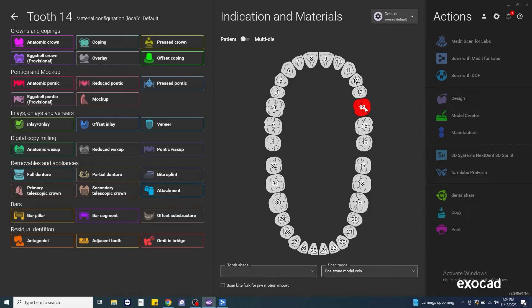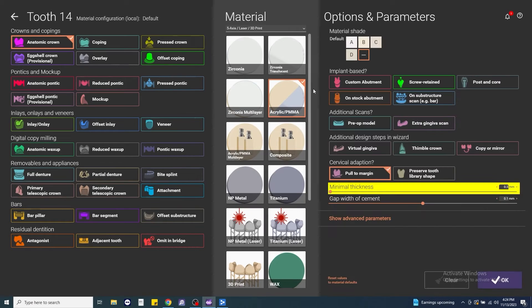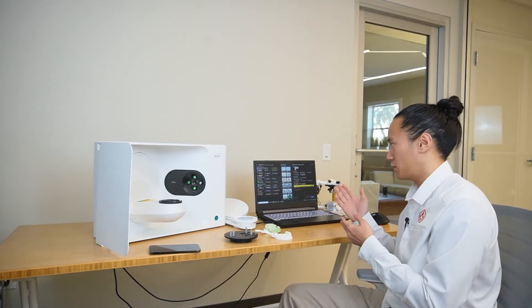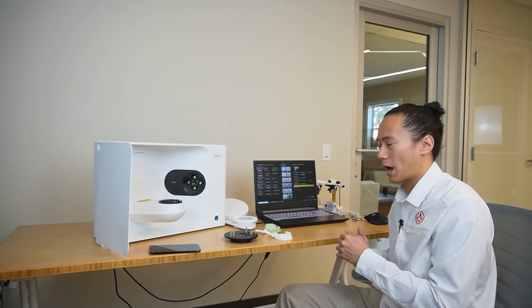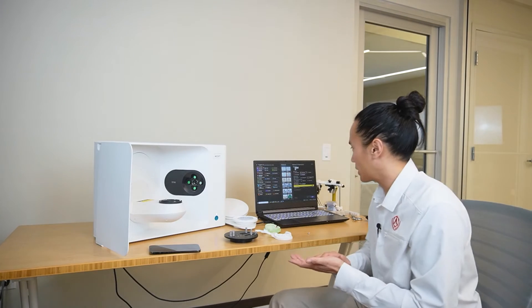And we'll set up our working tooth first, anatomic crown. We'll mill this out in PMMA. We'll select our shade, A-shade. For implant-based options, if we were designing the custom abutment, then we would choose custom abutment here. But if we're just using a screw retained crown, we'll select screw retained.